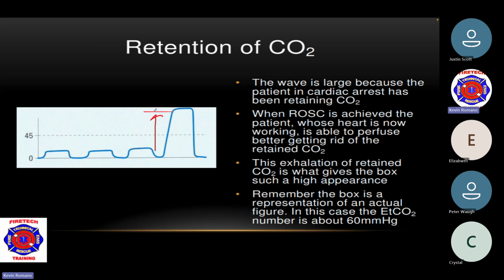It's okay. That's a good thing that you see that. So keep ventilating the patient, okay? Keep breathing for them. Run all your ROSC treatments from 12 leads to meds to pressors, whatever needs to be done to keep this patient alive and a heartbeat going. This will eventually normalize. Eventually, you just have to give it time, right?